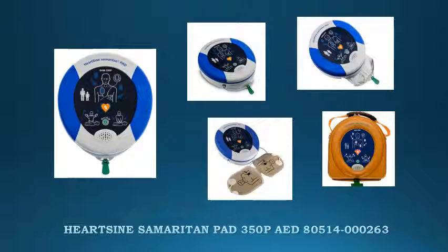The 350P is suitable for use on adults and children. For children younger than 8 years or weighing less than 25 kilograms or 55 pounds, a pediatric pack is available. The device has easy-to-follow visual and verbal guides, making it user-friendly and easy to understand.